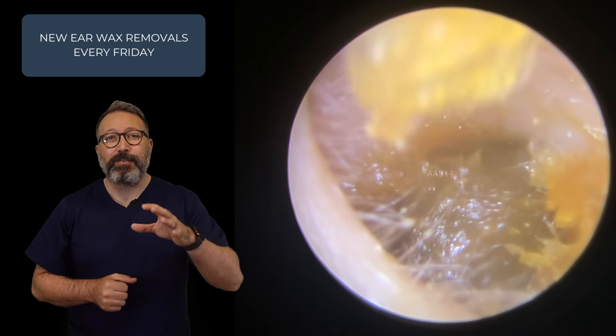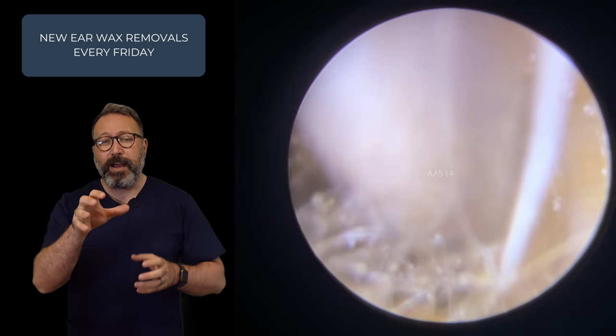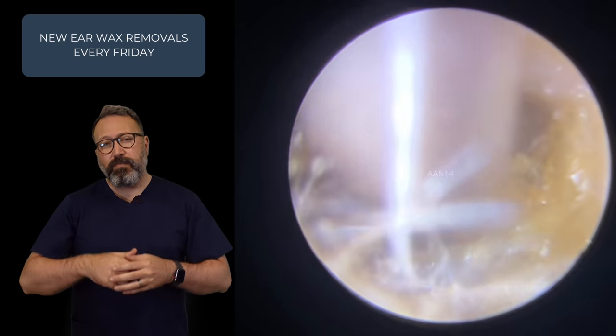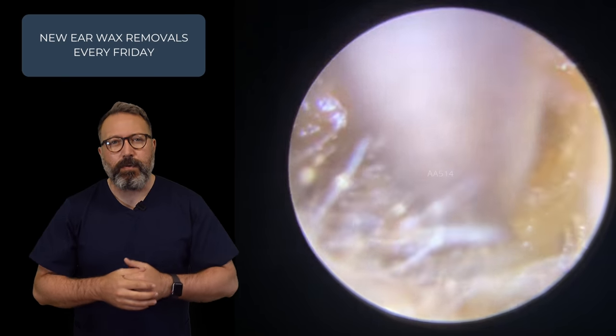I apologize for my voice being a little bit croaky — I've had to do a lot of shouting over the last two days so people can hear me. But as we get a grip on this wax, it's starting to very, very slowly come down the ear canal. To the right-hand side there, you can just see a little bit of dry skin as well, which is holding against this stickier nature to this ear wax.